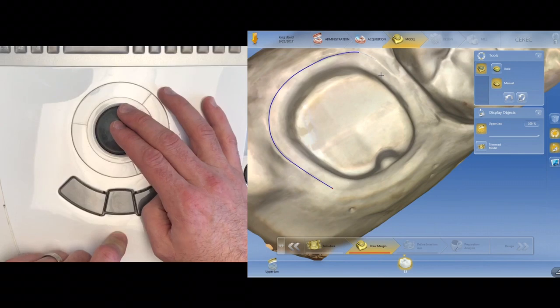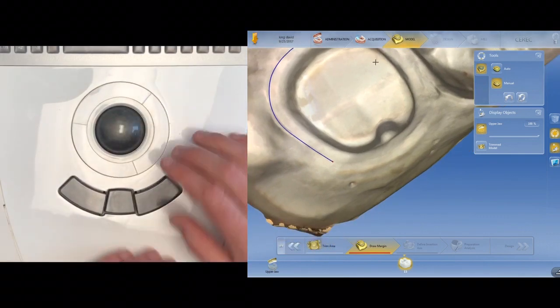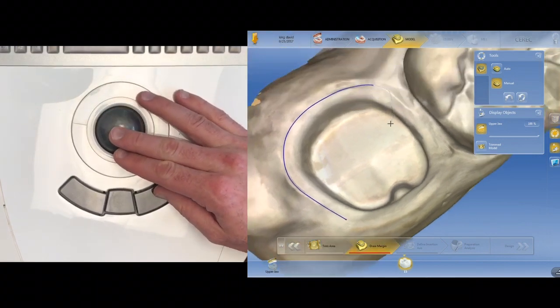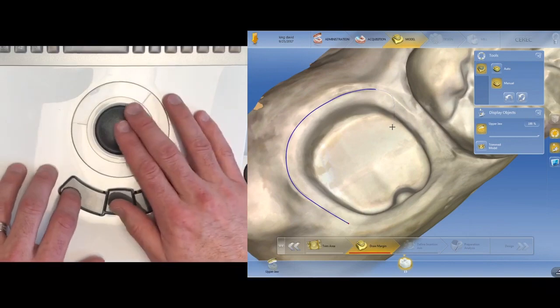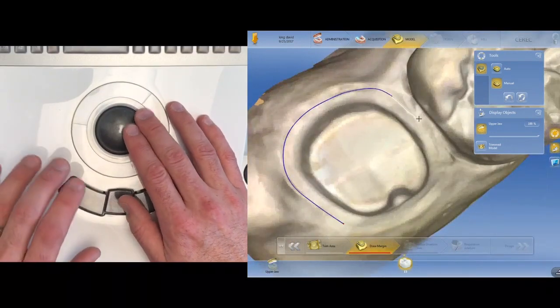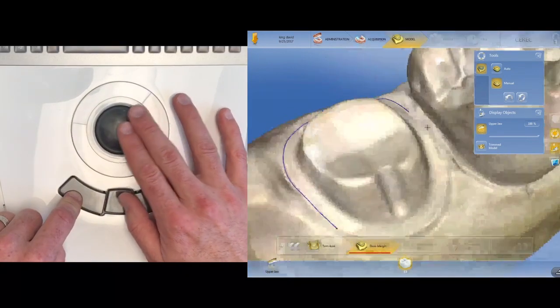And let's just say I couldn't see my margin anymore, so I want to pan down, so I'm going to use that right button. And for me, I like to use my thumb. Grab, press and hold, and then drag it down. And then you can let go and move it around. So the moment you click it, then it applies the margin. All right? But if you press and hold, it'll grab the model.